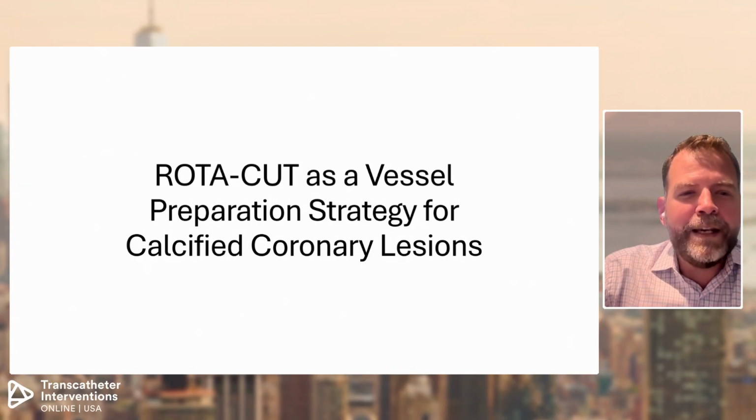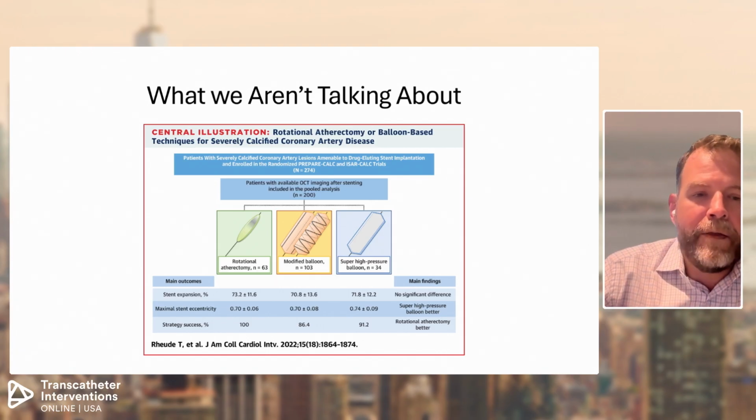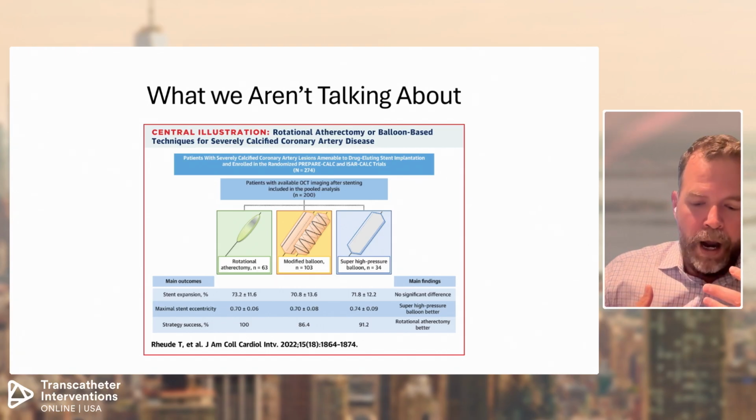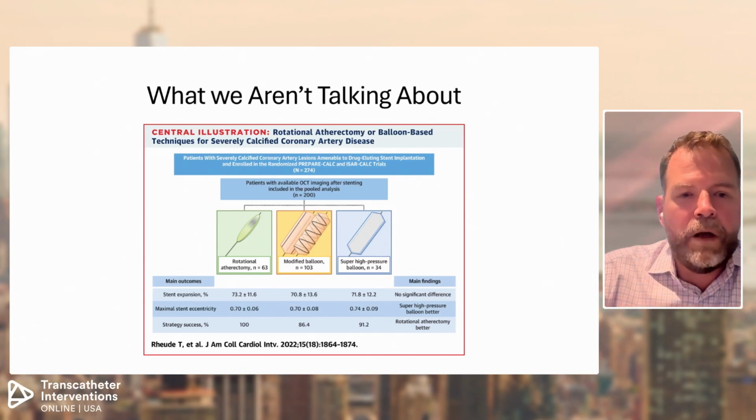Anyway, so looking at rotacut as vessel prep for calcified lesions specifically, what we're not talking about is atherectomy versus balloons. When we talk about all this nomenclature, I want to make sure we know what we're not talking about and what we are talking about.